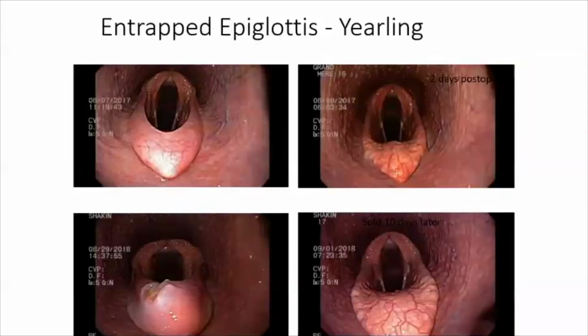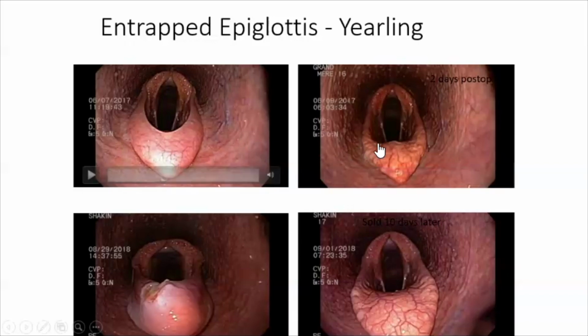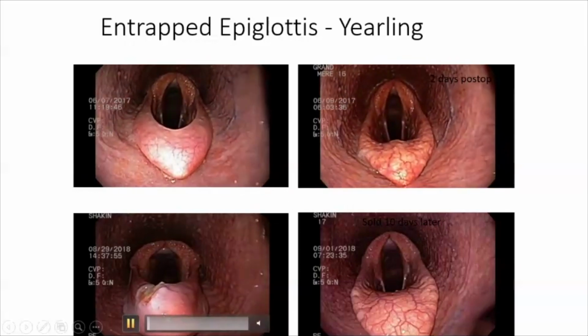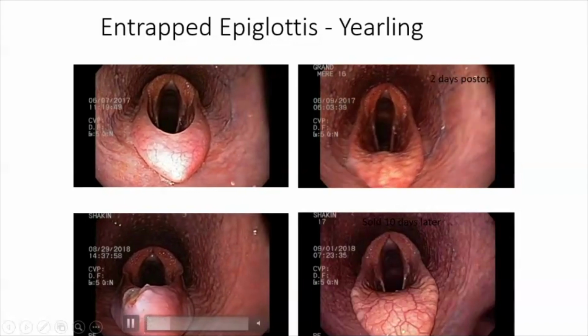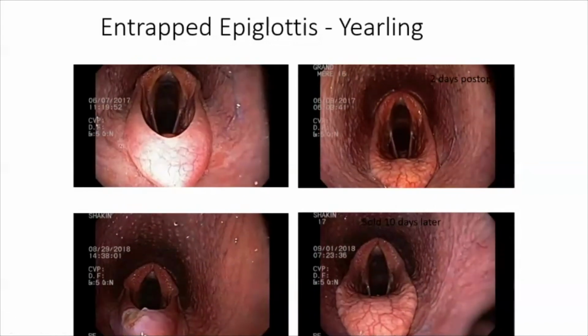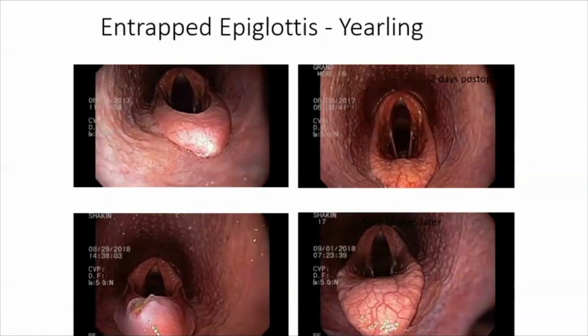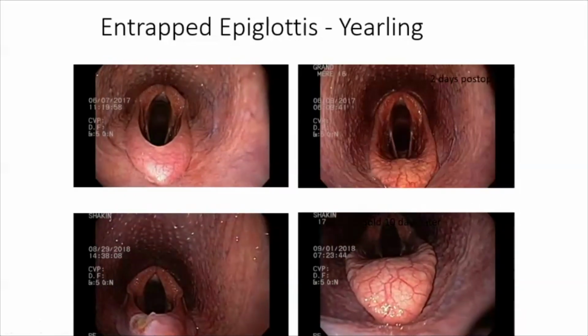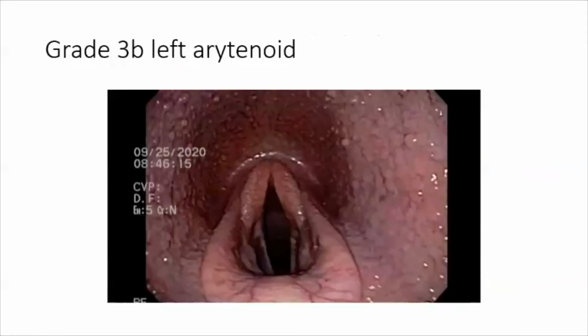Any more slides? Here are a couple examples of entrapped epiglottis and what they look like when we got them unentrapped. It's the same horse: the upper left is the same horse as the upper right after we did the surgery, and the same thing on the bottom. In the lower left one, the tissue entrapping the epiglottis is more thickened and inflamed. But once we got it off of there, that's what it normally looked like. So the images on the right side are after the surgery? Correct. Yeah, they look fairly normal. Good to see.